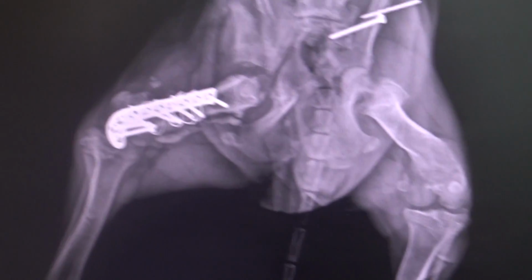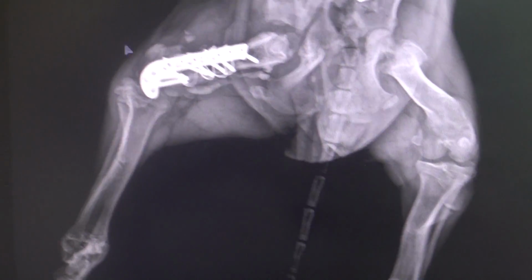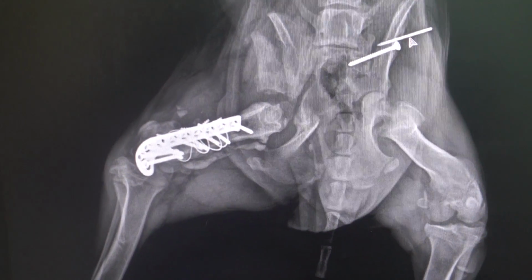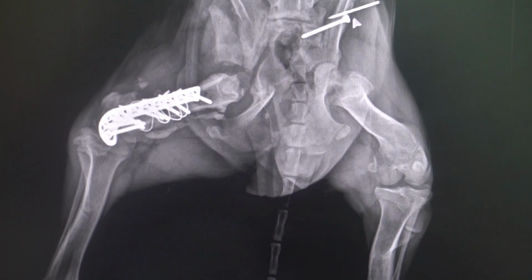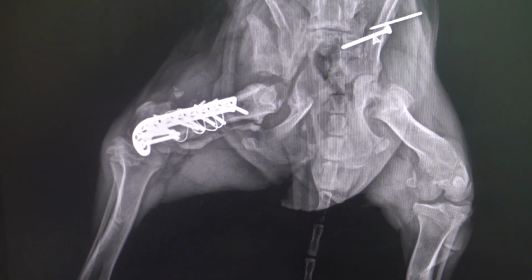Here is the VD view. We still have her under anesthesia, but just wanted to make sure everything was in the place where we wanted. This is just a little pin to help hold everything together so that the bigger screw can be driven in. And so that has been placed.